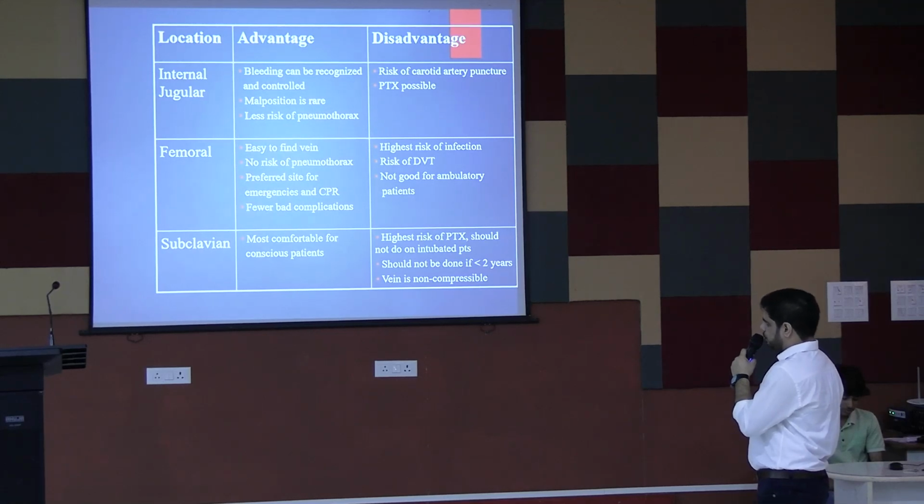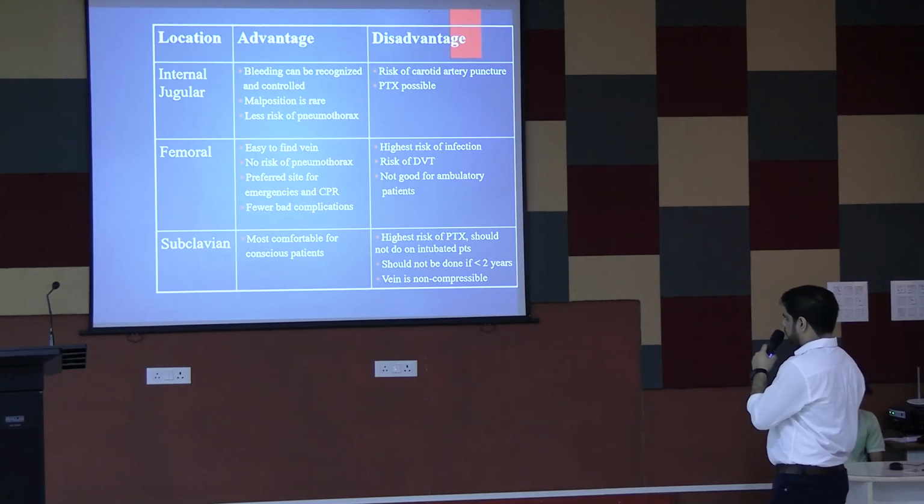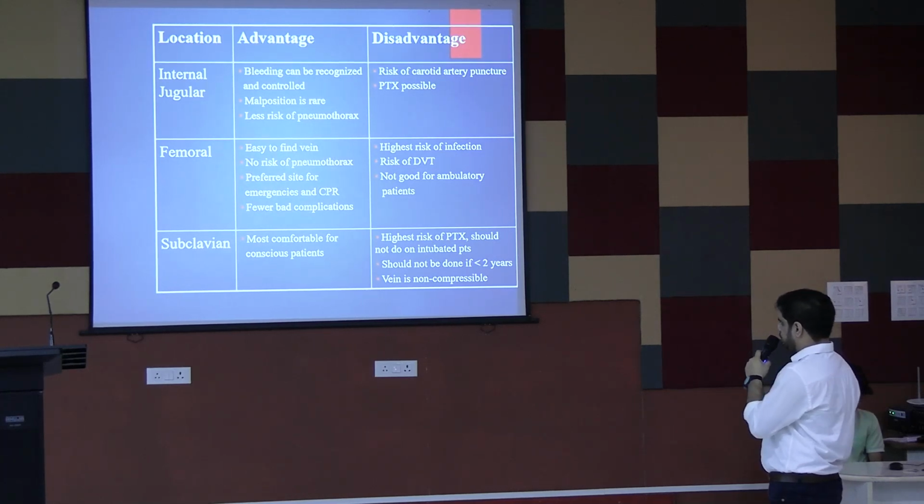Subclavian advantage: most comfortable for a conscious patient. Disadvantages: highest risk of pneumothorax, should not be done on an intubated patient, should not be done if less than 2 years old, vein is non-compressible.